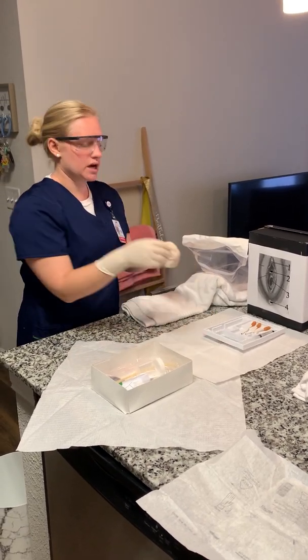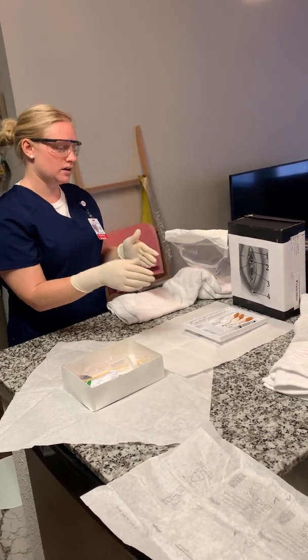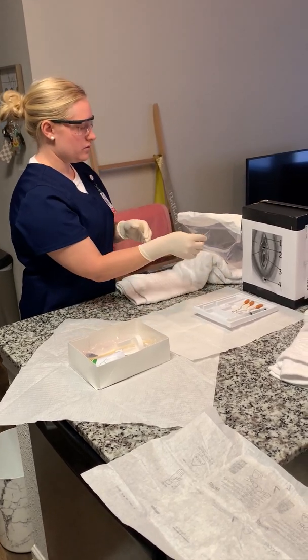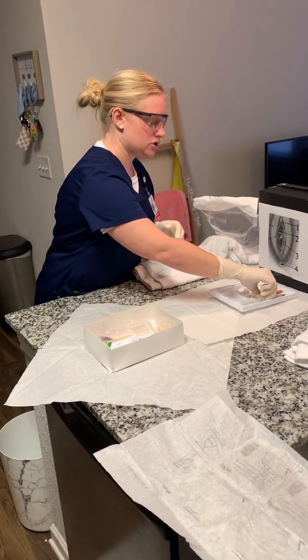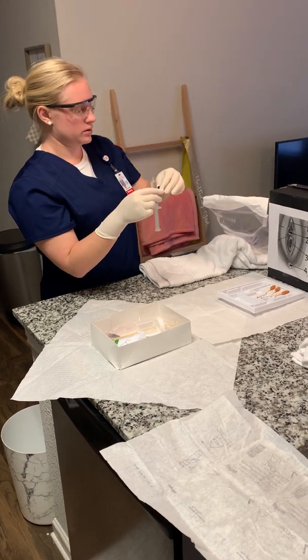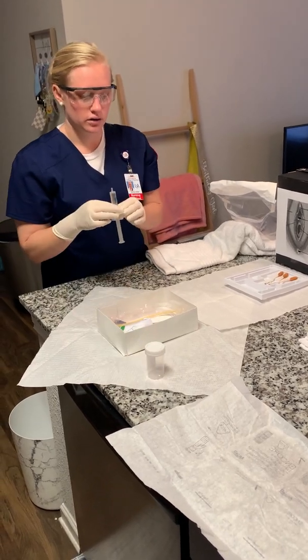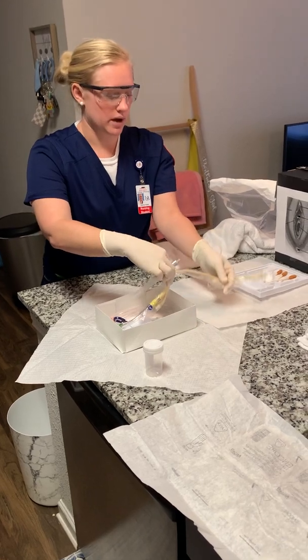and I would usually unpackage my betadine swabs, but I already have them undone. And then I would take the lube and put some right here and throw that away. And then I'm going to get my syringe, uncap it, throw the cap away, and then I'm going to take this out for later and put my syringe on my port.